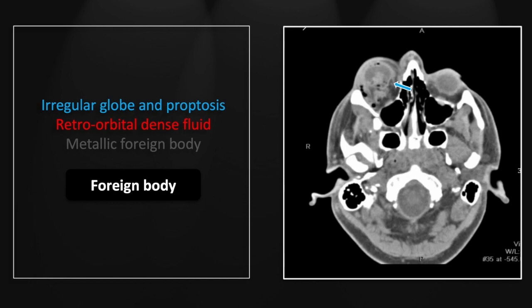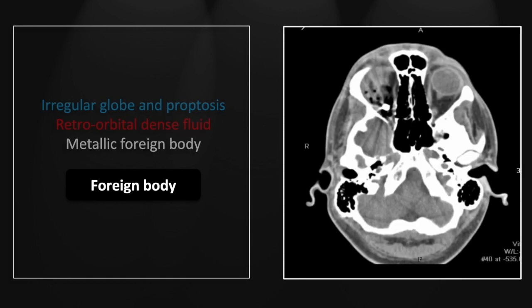There is significant retrobulbar density as well as gas, and significant density within the globe. The lens is entirely disrupted and most likely some of it is displaced posteriorly. Here we see the offending foreign body — the BB — lying in the retrobulbar orbit, and luckily not within the brain itself.